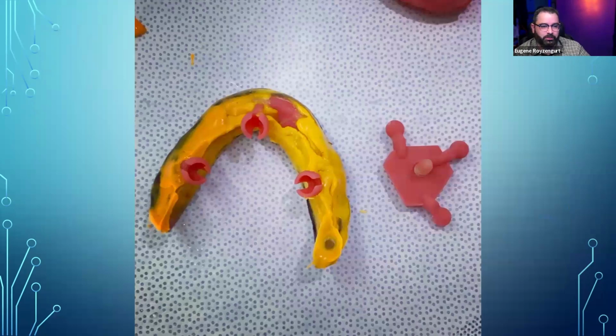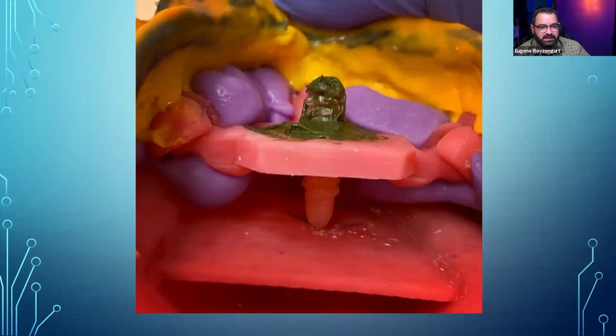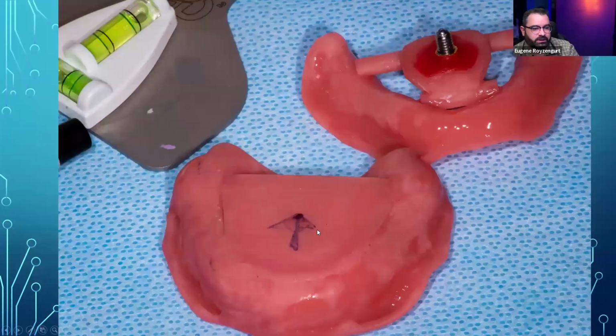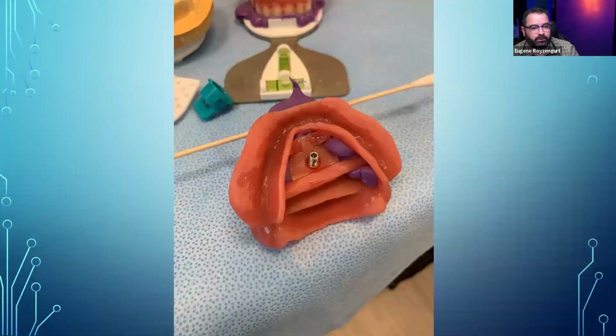As you can see right here, wash impression, little ball and socket thing, place it on top of it, attach everything. I use a little bit of compound to make sure I adjust it. Basically, you adjust the screw to go up and down, and with that screw, you adjust your vertical dimension. So you want to establish your vertical dimension first, and then you do your protrusive and lateral movements to create this thing right here. And the top of this point is actually your centric relation, guys, okay? So it works out pretty well.